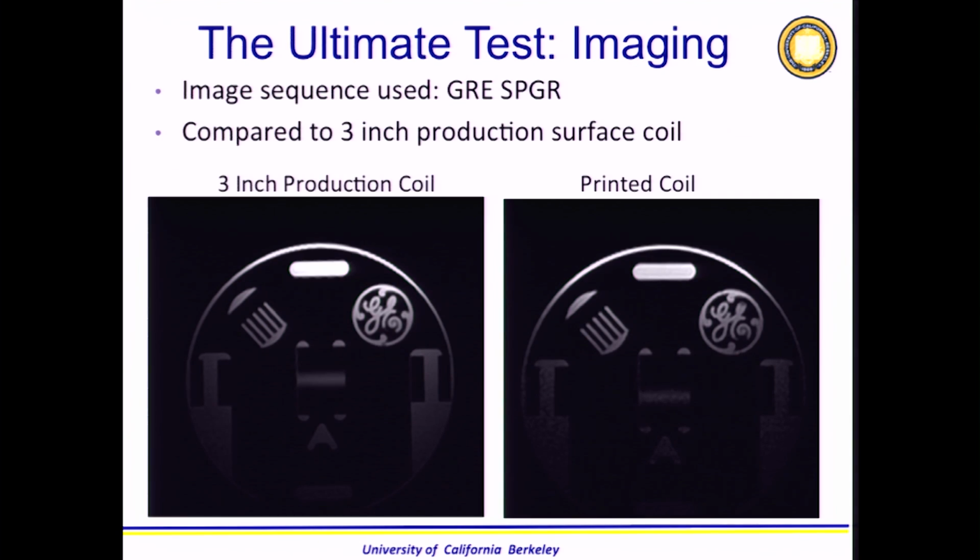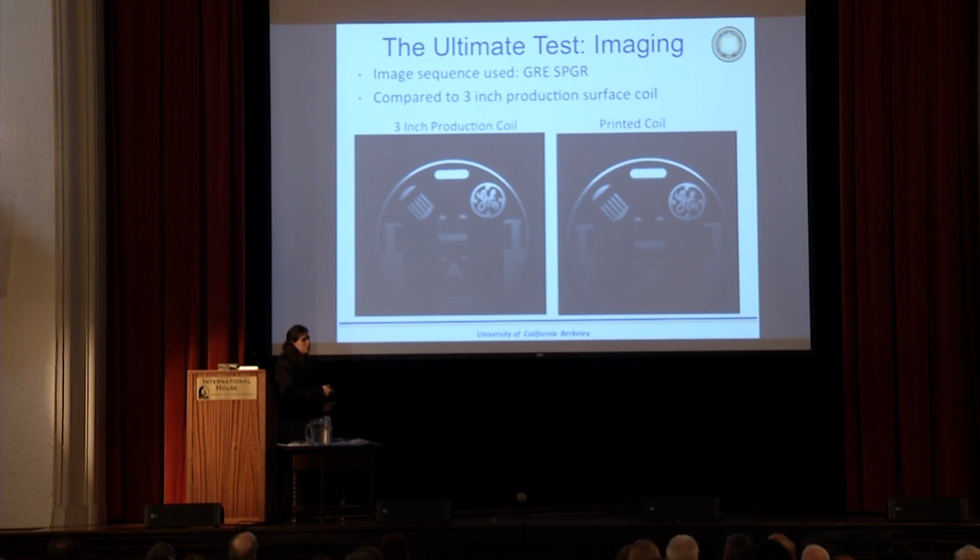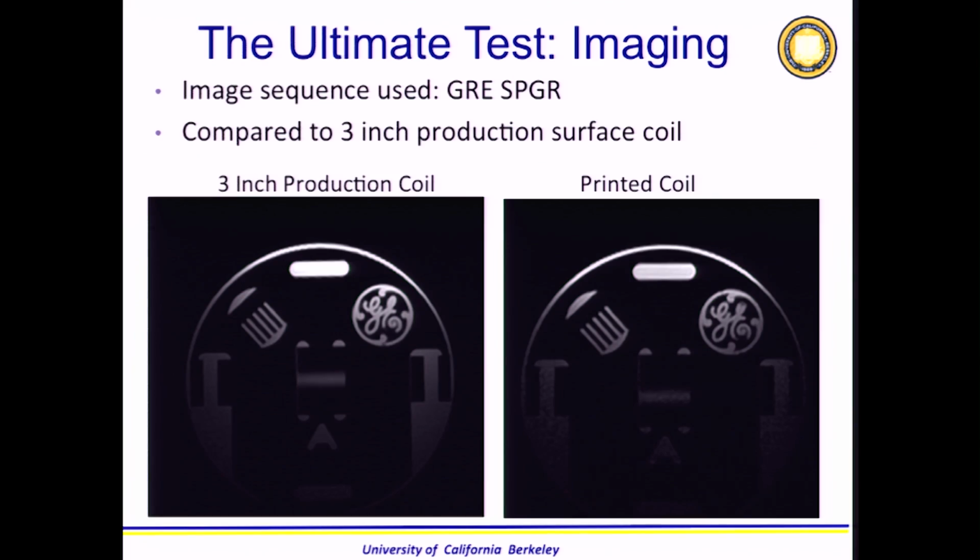So you're comparing here 3-inch coils with these printed coils. This is a phantom made by GE, so you can see here that the image is very comparable. Of course, we measured the SNR, and now we compare the SNR with traditional coils versus printed coils. And we want to be fair, and we only pick traditional coils where we can fit to the part of the body that we want to measure.